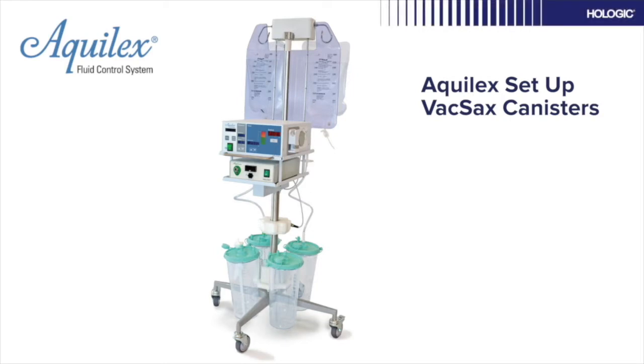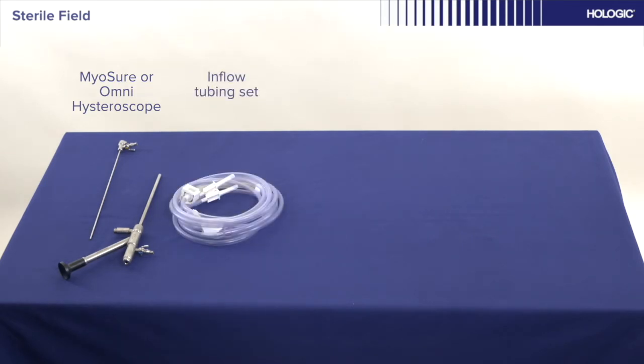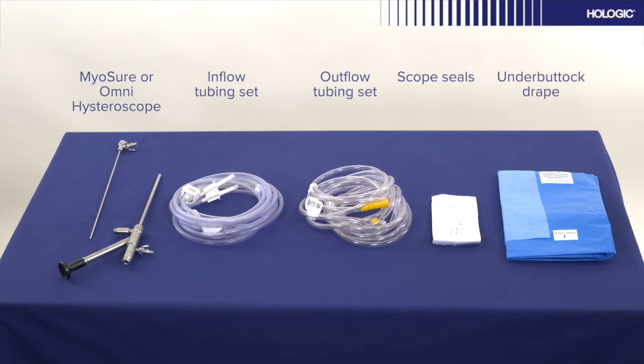These are the items required for carrying out a procedure using the Aquilex Fluid Management System. The following consumable items will be received into the sterile field: one MyoSure or Omni hysteroscope, one inflow tubing set, one outflow tubing set, one packet of scope seals, and one under buttock drape.